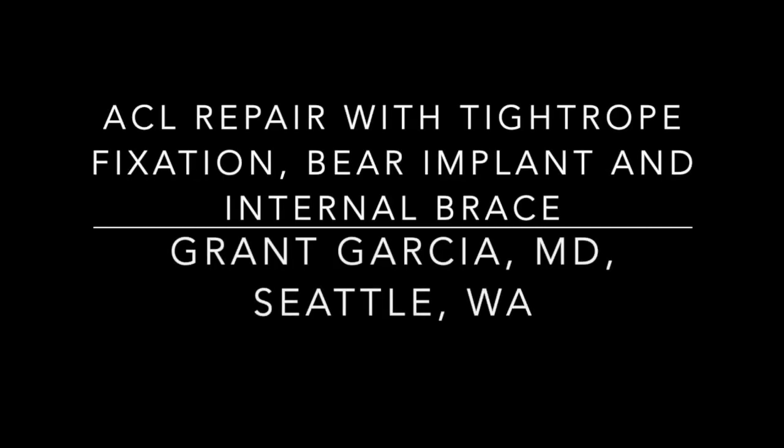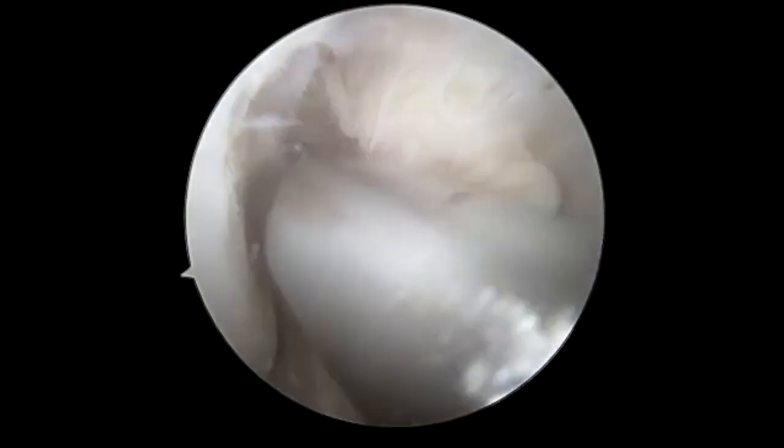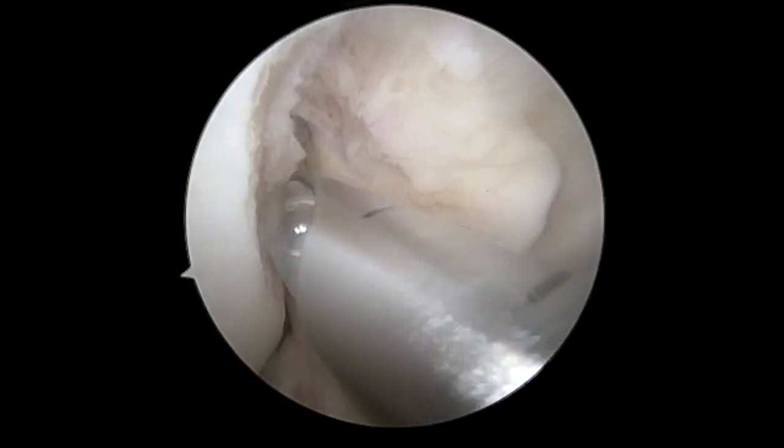Today we're going to demonstrate a unique hybrid technique using the Arthrex ACL repair tightrope as well as the BEAR implant.